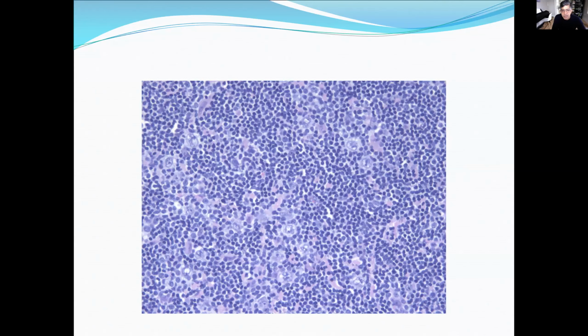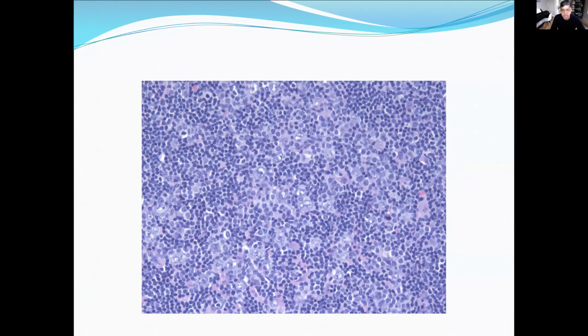I'm trying to apply a rule of few tumor cells versus sheets of tumor cells, and I don't know where this fits. Looking at this power, do we think there are few tumor cells there, or is it sheets of ugly cells? Any thoughts? Anybody? This is actually a slam dunk and straightforward case. So yeah, we do see some cells there that are funky looking. We already have an answer, as I expected, from a pathologist from CMC, who I'm not going to name now.